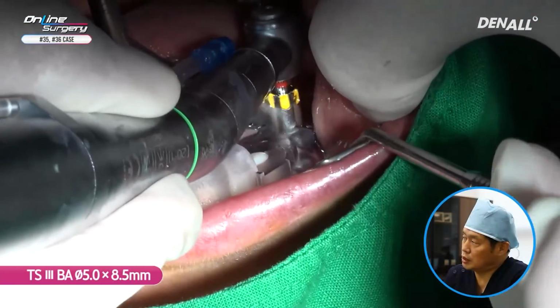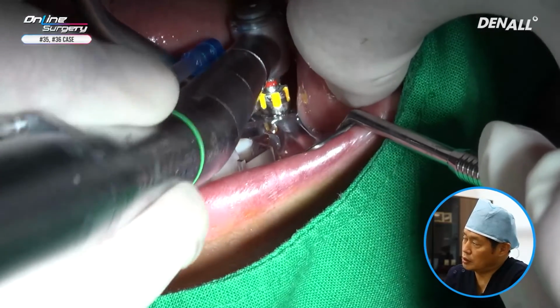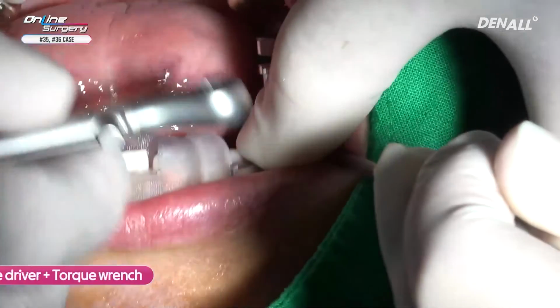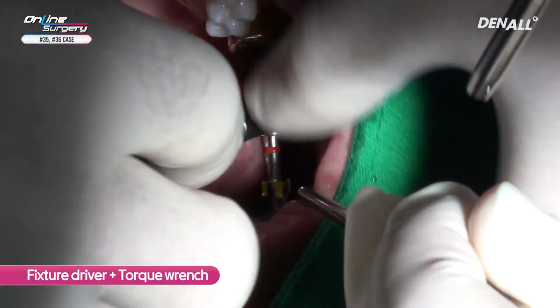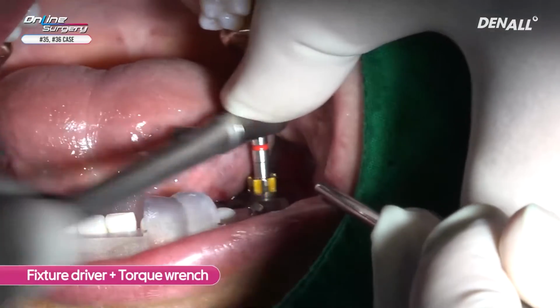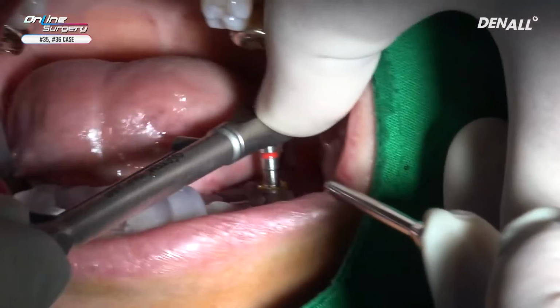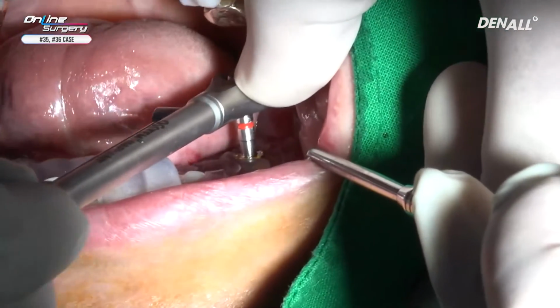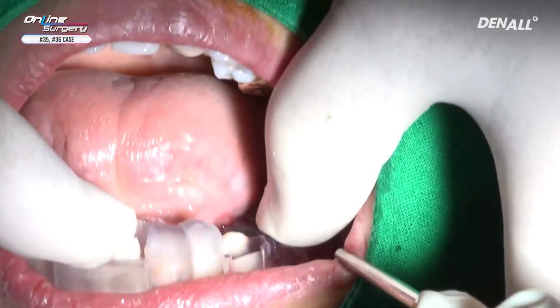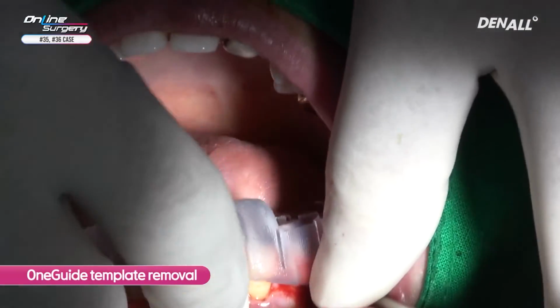As mentioned earlier, considering the patient's level of mouth opening, I decided to place 8.5 implant. Say ah wider. All implants have been placed.